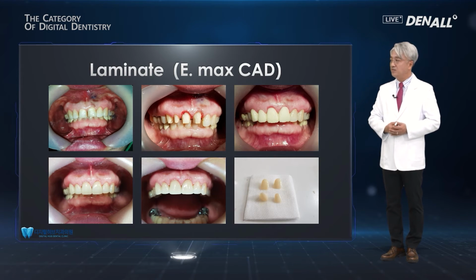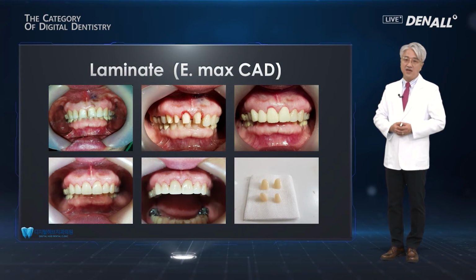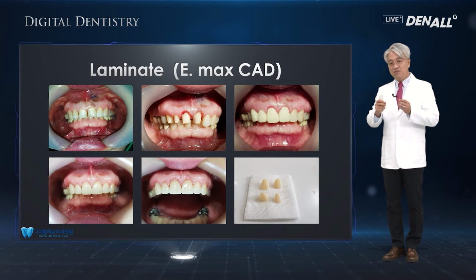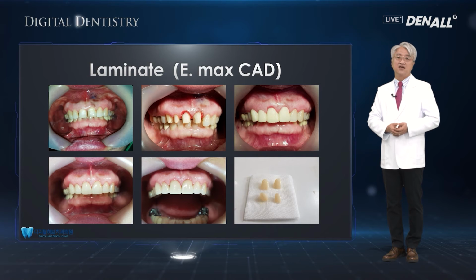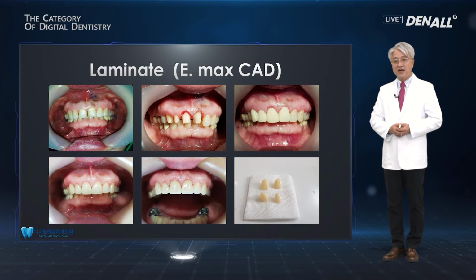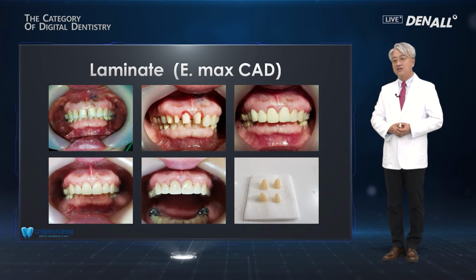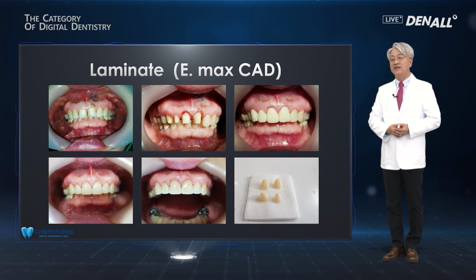Actually, all ceramic on the anterior side is aesthetic dentistry, so it requires skillful technicians, which means it required a lot of experience and skill. But thanks to CAD/CAM, in general dental clinics, a very satisfactory result like this can now be obtained. So if you become used to using digital dentistry, I believe in your clinic this level of high quality anterior aesthetic prosthesis treatment would also be possible.